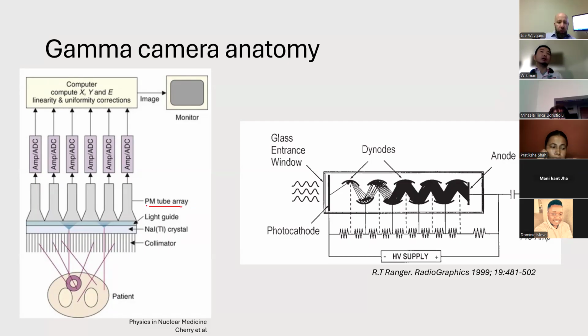It's called a photomultiplier. What it does, as you can see here, is that visible light comes in and it converts it to an electron. The electron then goes through dynodes, which are at different potentials. Their function is to accelerate the electron, right? Once the electron hits a dynode, it creates more electrons. You keep doing that, and you're multiplying your signal. So that's the PMT.